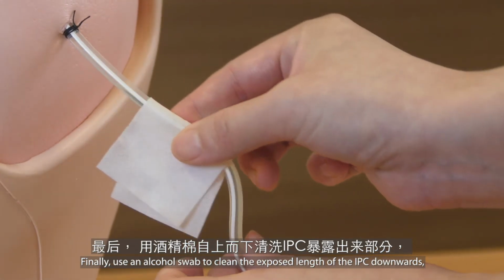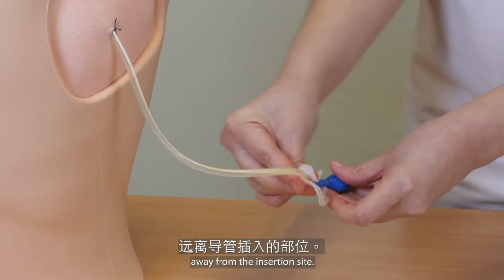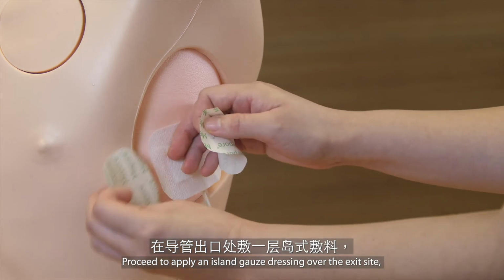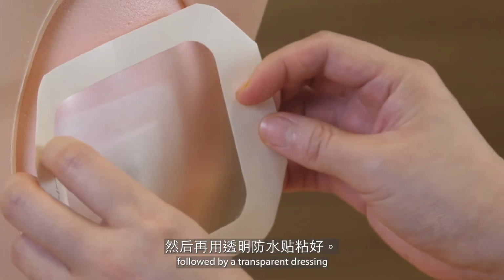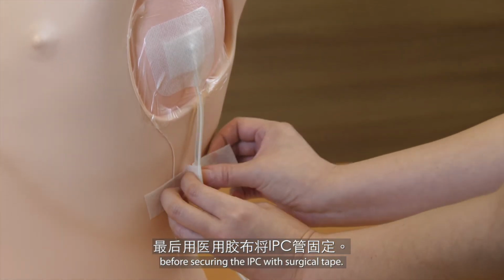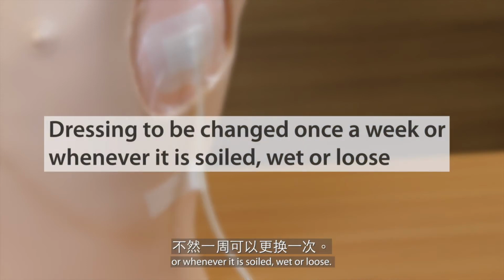Finally, use an alcohol swab to clean the exposed length of the IPC downwards, away from the insertion site. Proceed to apply an island gauze dressing over the exit site, followed by a transparent dressing, before securing the IPC with surgical tape. The dressing should be changed once a week or whenever it is soiled, wet, or loose.